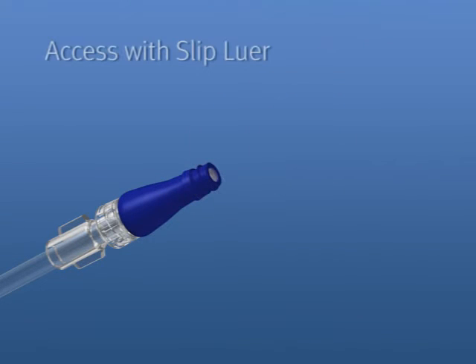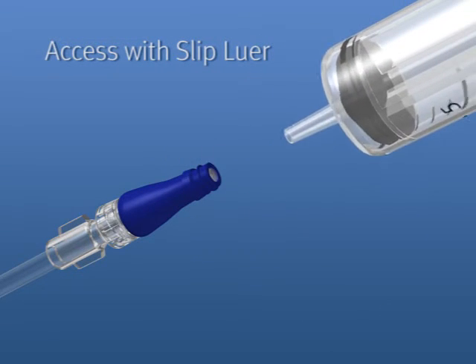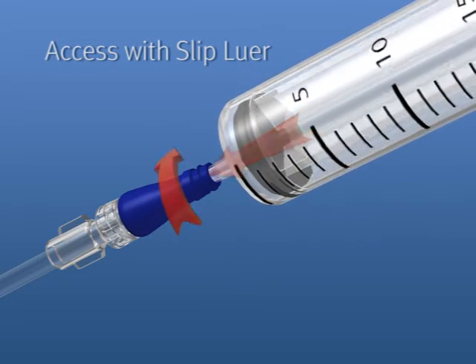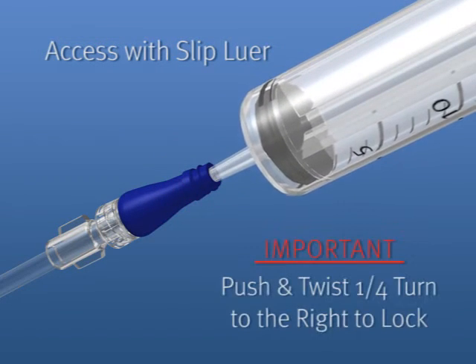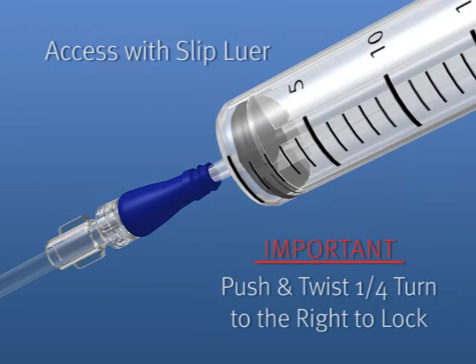To access the Microclave with a slip lure, swab the top of the connector with alcohol. Insert the lure into the Microclave. Push and twist one quarter turn to the right to lock the lure in place. It is important to push and twist one quarter turn to the right to ensure a secure connection.